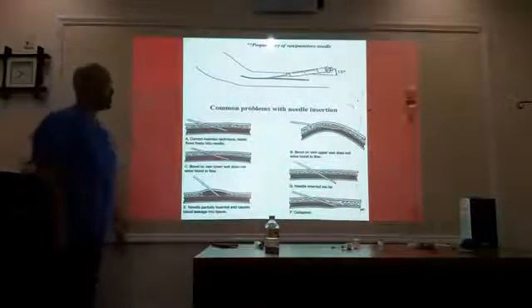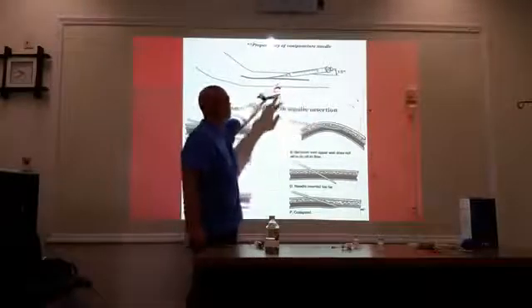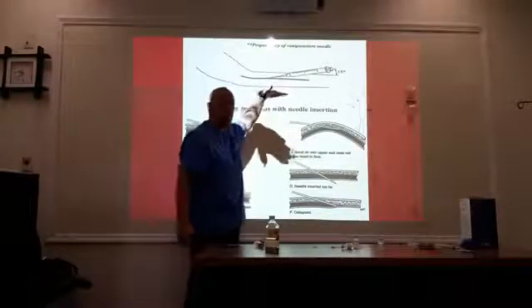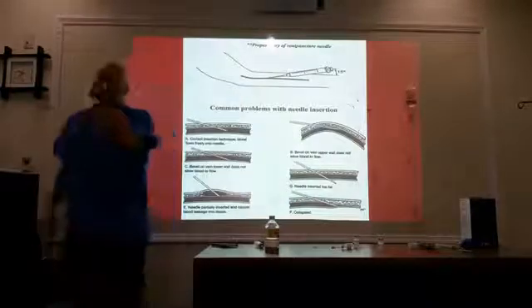Proper entry of venipuncture needle. So again, you're going to go about 20 to 45 degrees. Once you've got in, you're going to lower it to almost go parallel with the vessel.